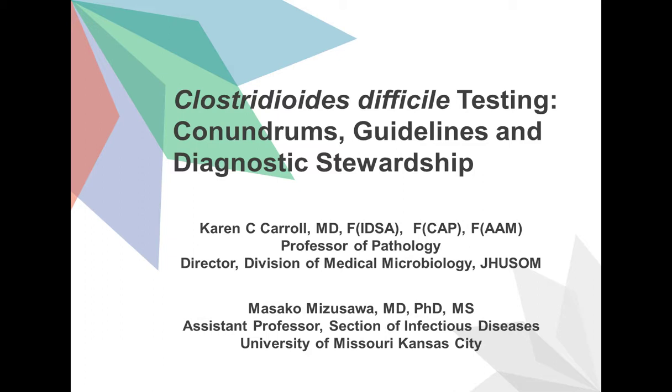Okay, and looks like we have time for just a few more. This one's a little long, bear with me. In 2019, NHSN added this. When using a multi-step testing algorithm for CDI on the same unformed stool specimen, the finding of the last test performed on the specimen that is documented in the patient medical record will determine if the CDI positive laboratory assay definition is met. Right. This has led the C-suite community to push for NAT first and reflexive positives to free toxin testing to reduce the number of NHSN reportable lab ID events.